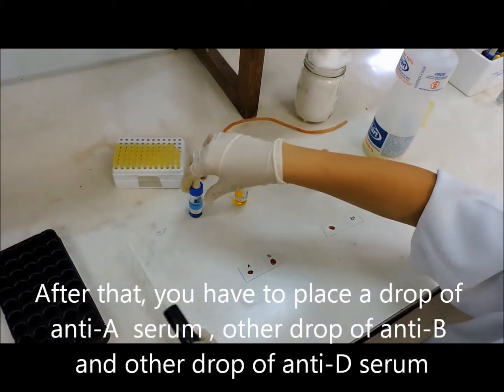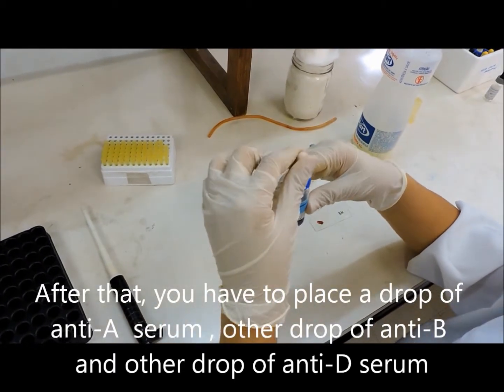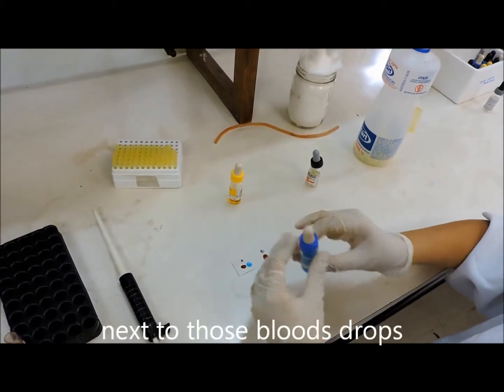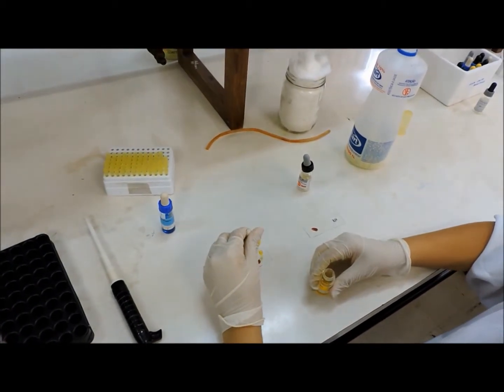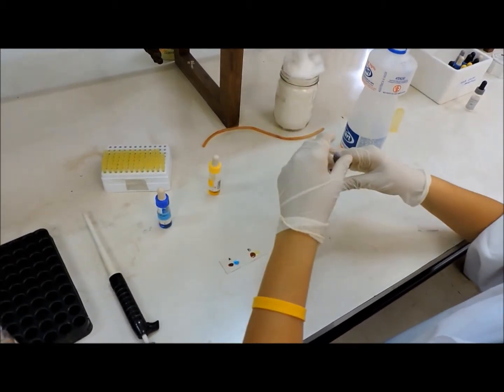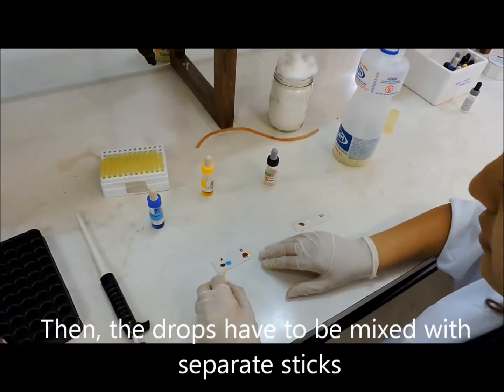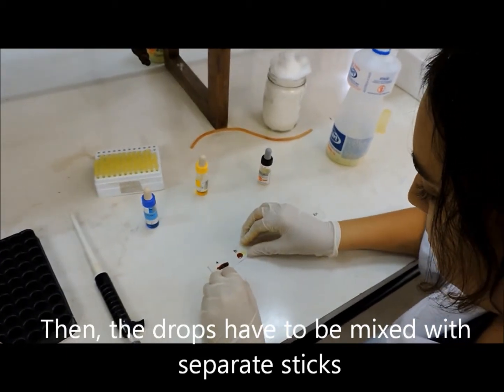After that, place a drop of anti-A serum, another drop of anti-B serum, and another drop of anti-D serum next to those blood drops. Then, the drops have to be mixed with separate sticks.